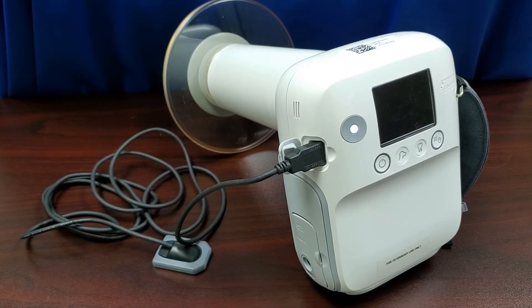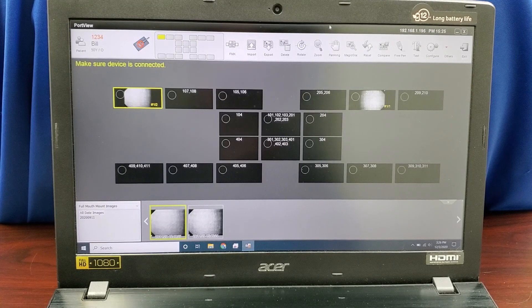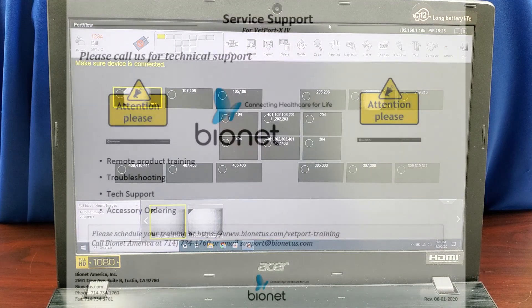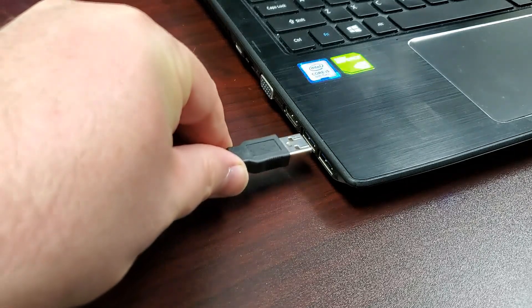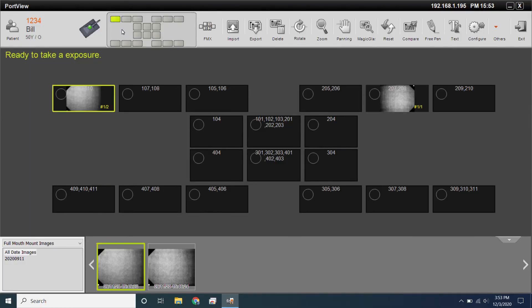There are three different configurations between the X-ray generator and the intraoral sensor when it comes to capturing your exposures. The first is accomplished via the intraoral sensor connected to a laptop or desktop PC. This will require that the PortView software is already installed and configured onto your computer. For help getting your PortView software installed, please call the number on the screen. With your PortView software properly installed, connect the intraoral sensor to your PC and start the program. You will know the sensor is connected to the program when you see the green dot on the sensor icon.